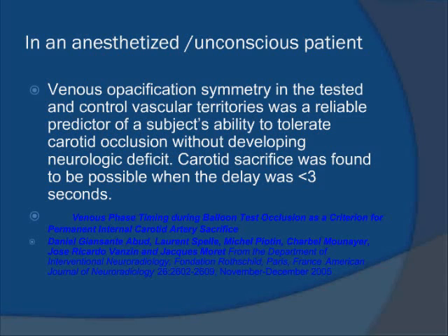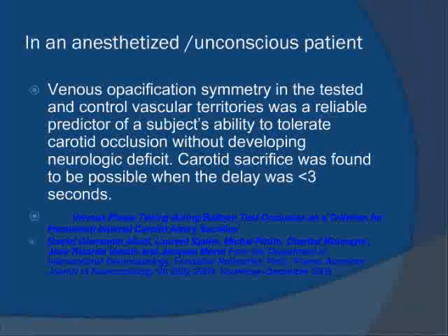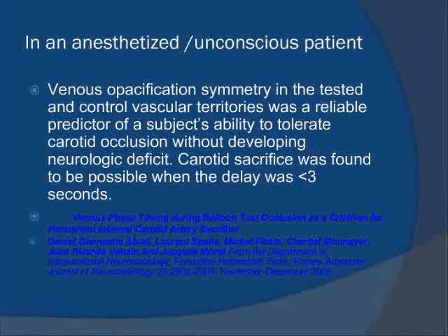So what we do is look at the venous drainage when it appears on the side of injection, look at the venous drainage on the side of the aneurysm with test occlusion and see the delay. In most patients you'll find the delay is not more than 1 second.